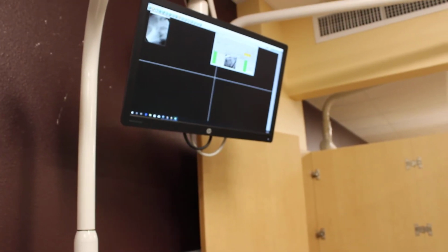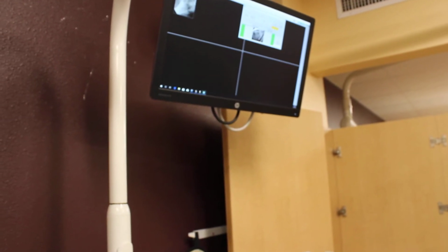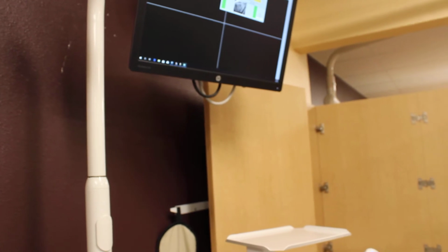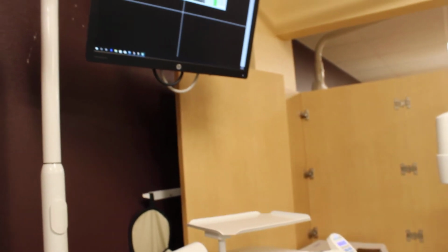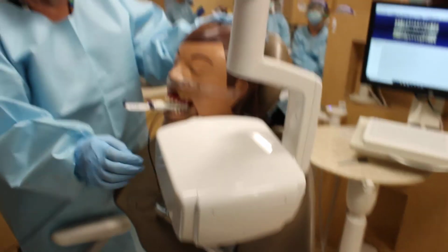That is a near perfect x-ray, because you needed the medial root of number 31, so you're good. Yeah, I've got all the roots. Yeah, that's good. You can diagnose it. It's got nuts and bolts and stuff because of him, but it's a near perfect x-ray.